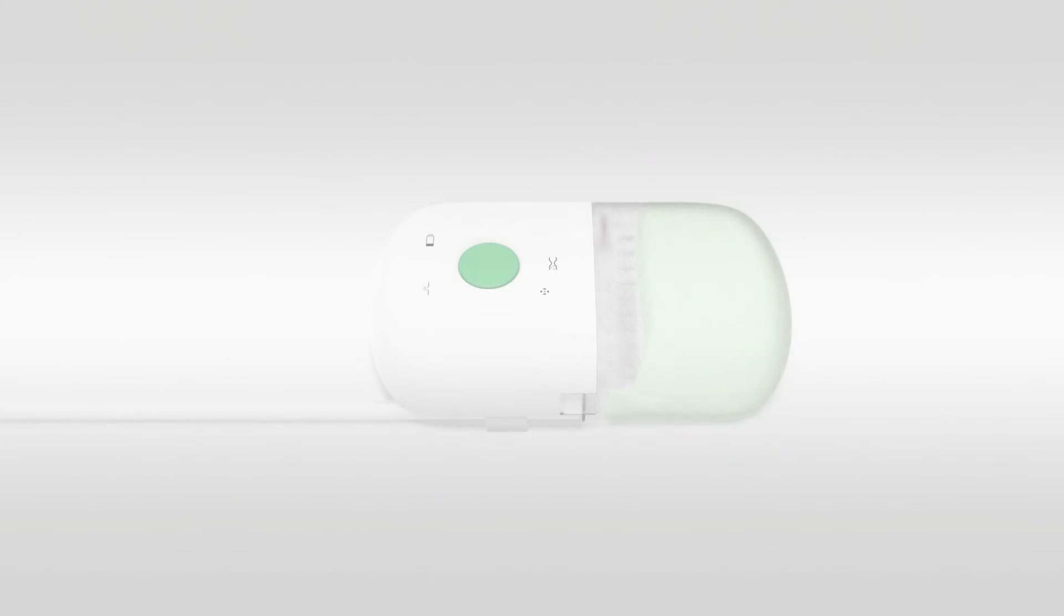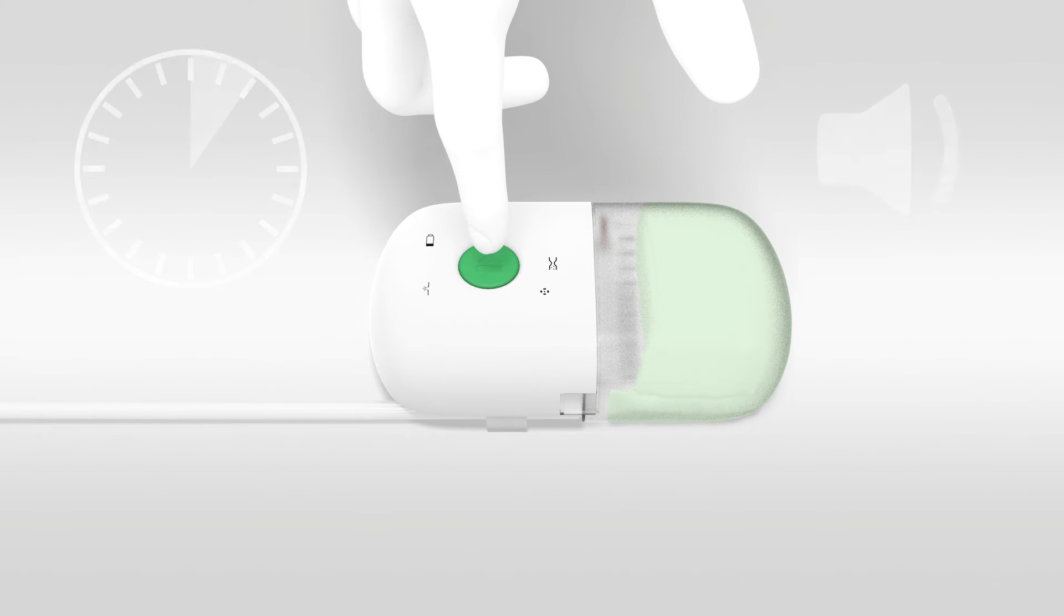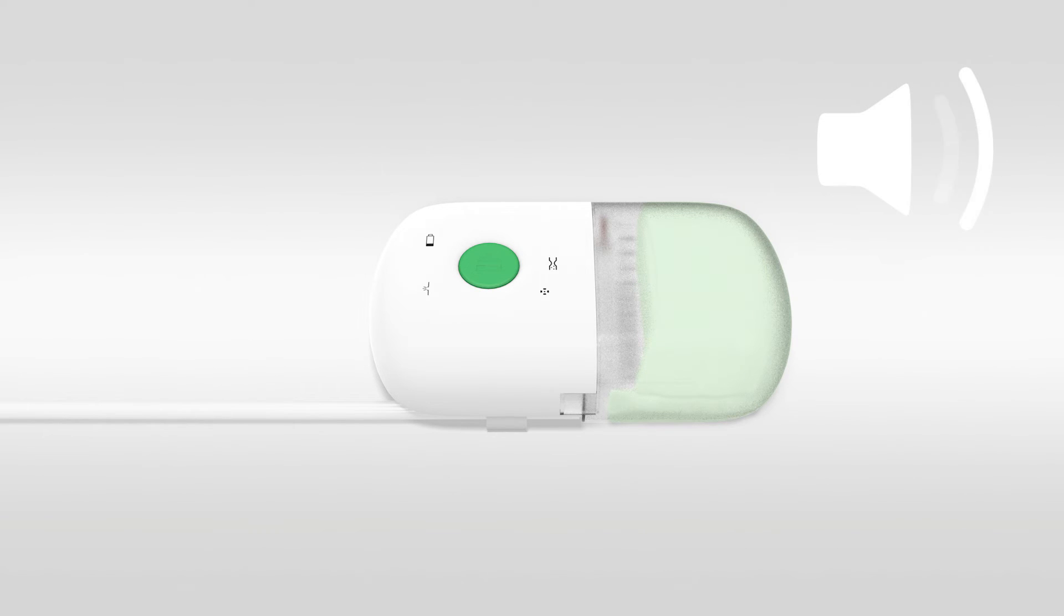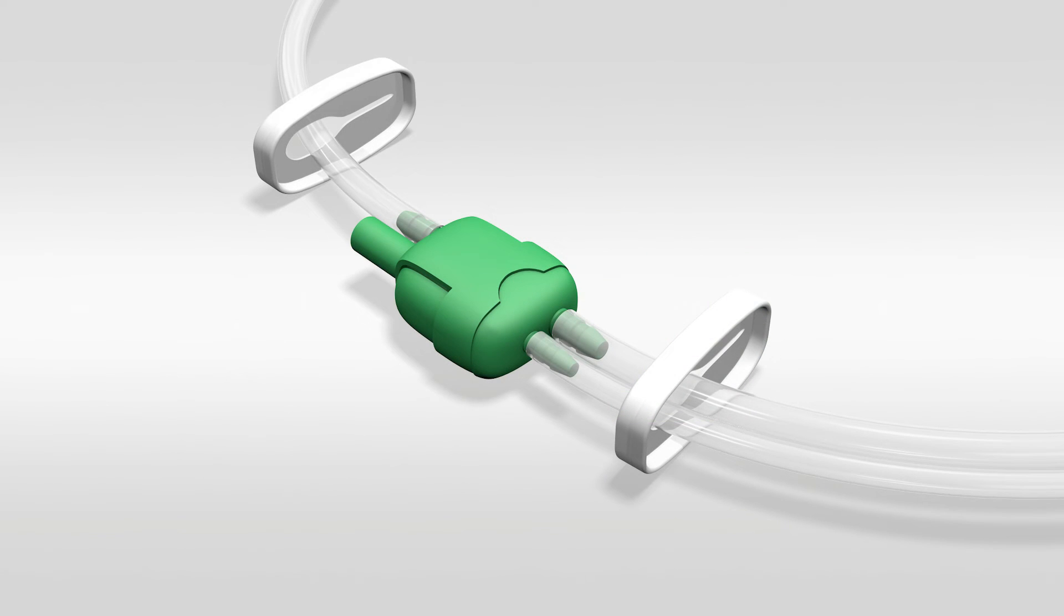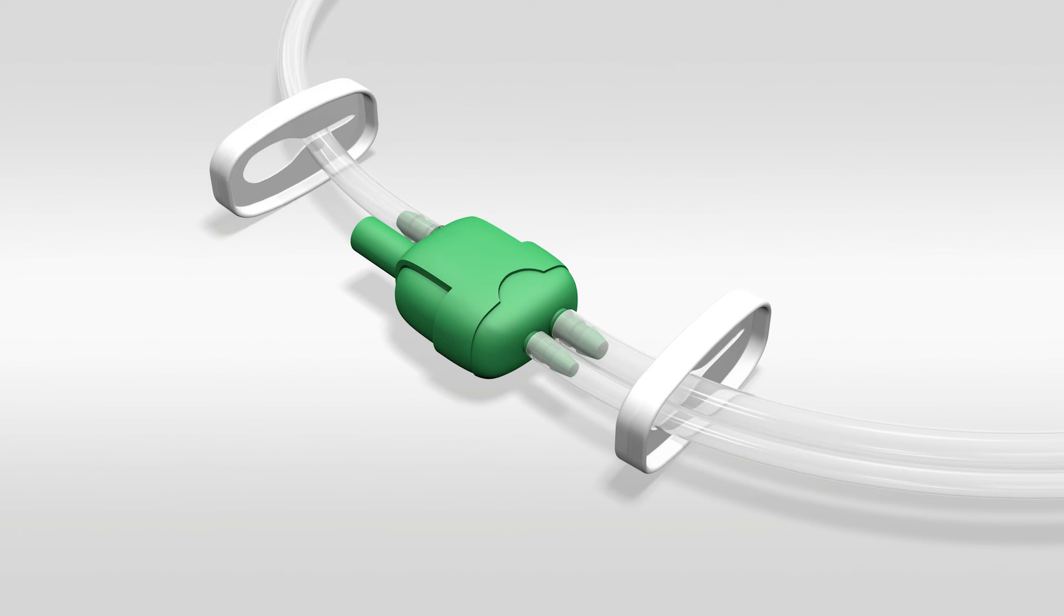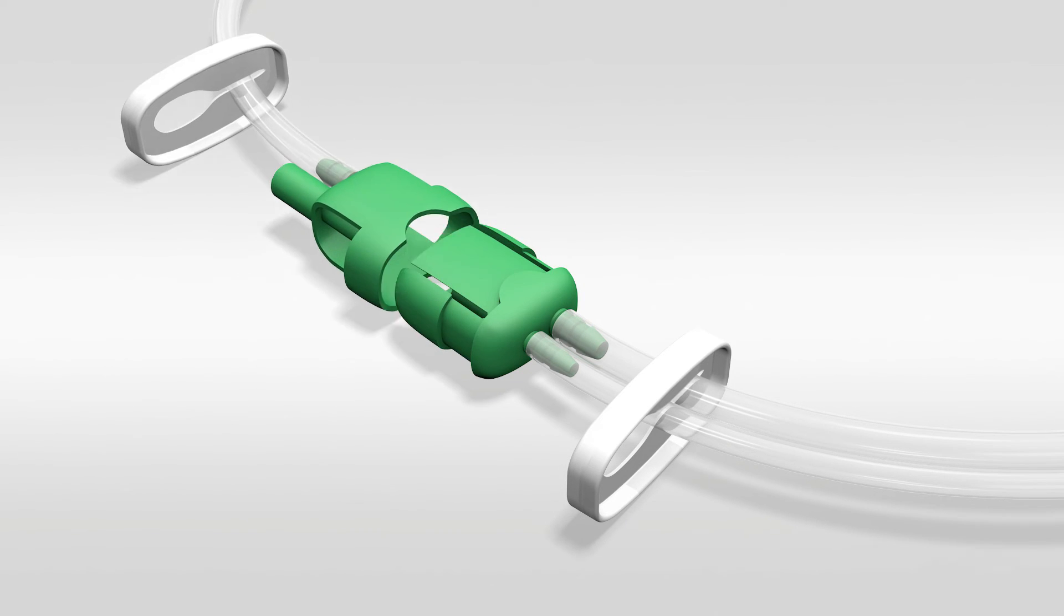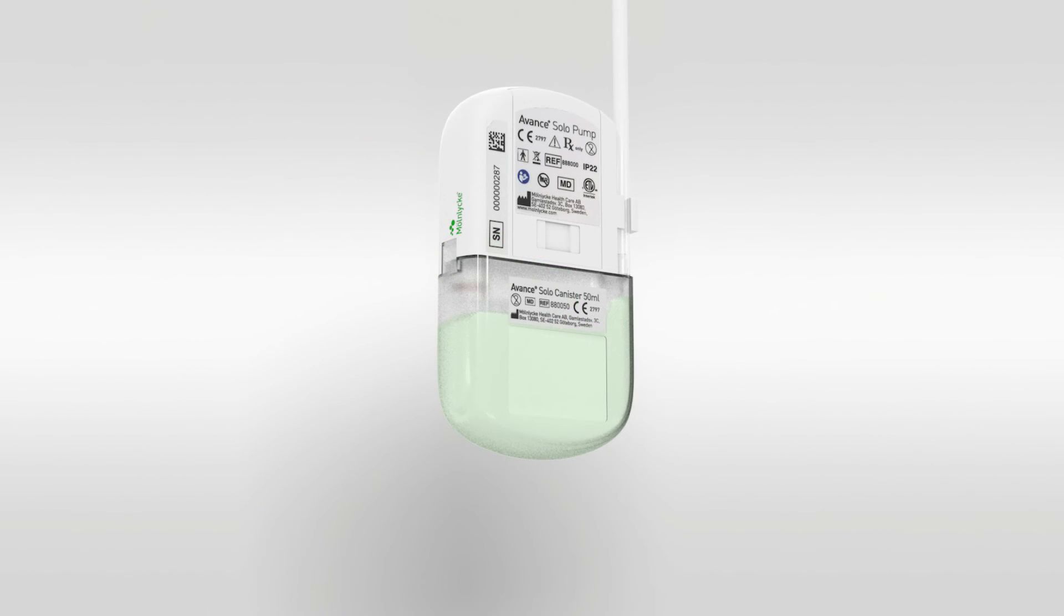To change the canister, first pause the pump by pushing on the green button for two seconds. The pump will emit two short audible notifications to confirm it is in pause mode. The audible notifications are repeated every 15 minutes as long as the therapy is paused. Next, slide the tubing clamps up close to the green connectors and then push both clamps across the tubing. This will minimise the potential for fluid leakage from the tubing when you disconnect the two tubes. You may now remove the canister.